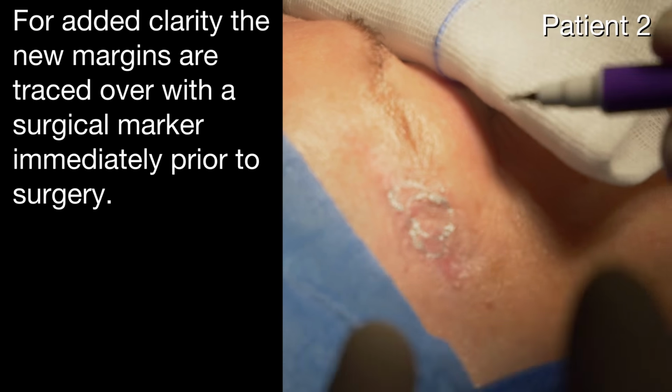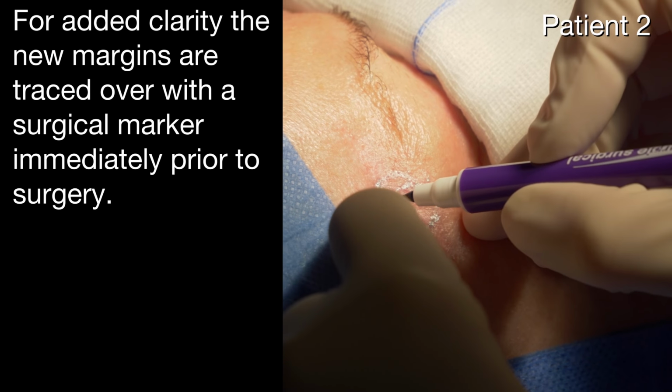I redraw the margin I marked before with the OCT.